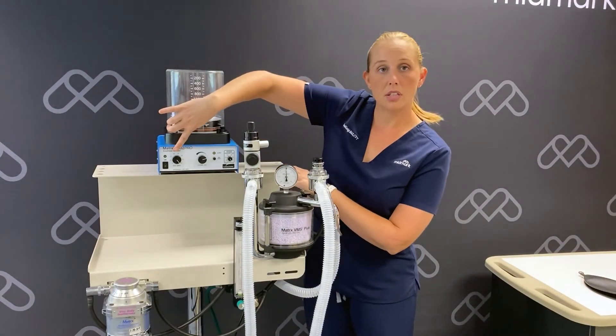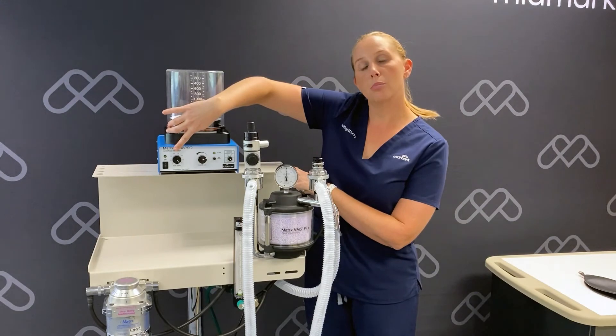Our rate control is used to set the respiratory rate and breaths per minute.